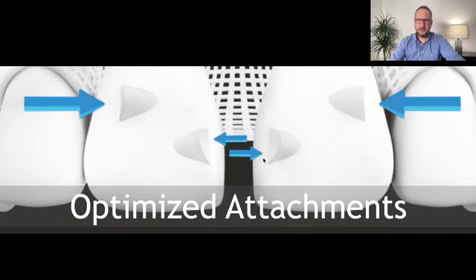Here is something that we don't have control over. We can only select if we want to remove and change for optimized attachments. In some situations, we can ask, let's say Invisalign, because it's the only company that is working with this kind of attachments nowadays, as far as I know, okay?